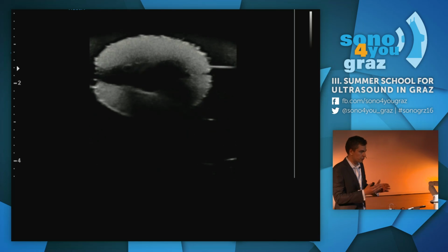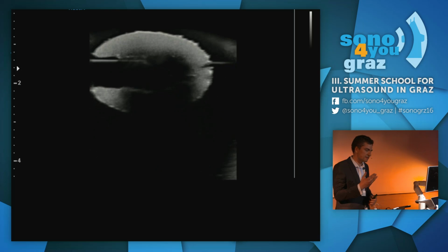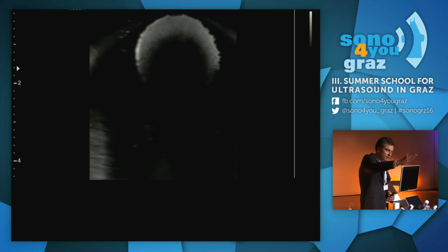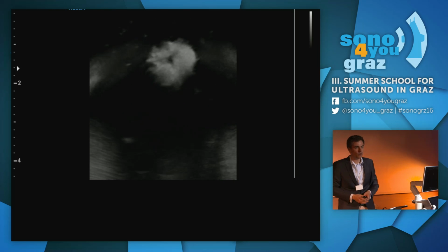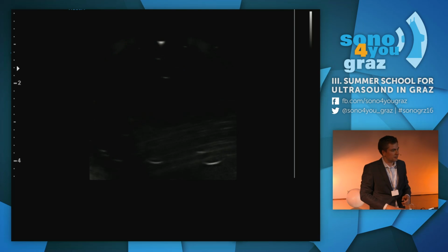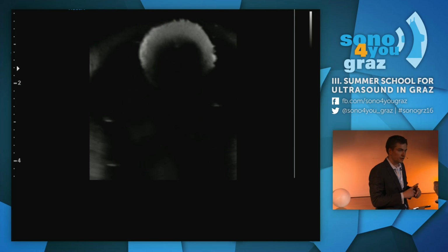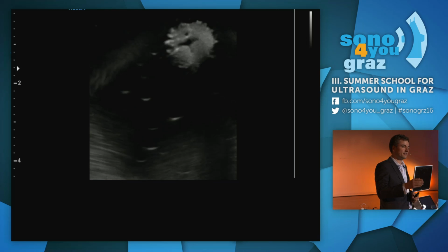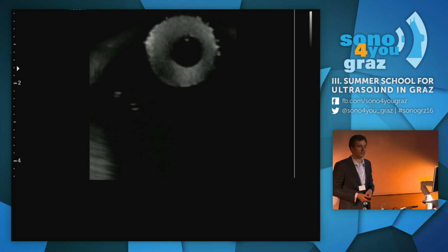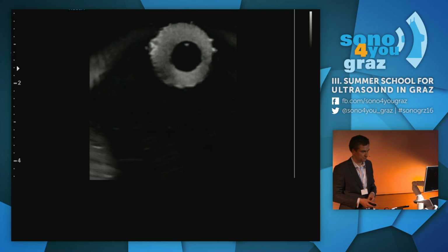And what you have to do to really understand the structure is to pan all the way up, all the way down, and you can see there the cross section at the end and the round hole on the other side. Can you see it?